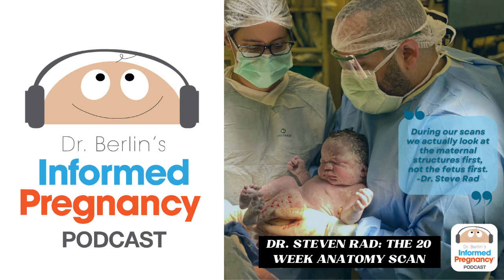In terms of empty bladder, full bladder, we have everyone empty their bladder before we do their vaginal ultrasound, and the ultrasound is so long that we want them to be comfortable.